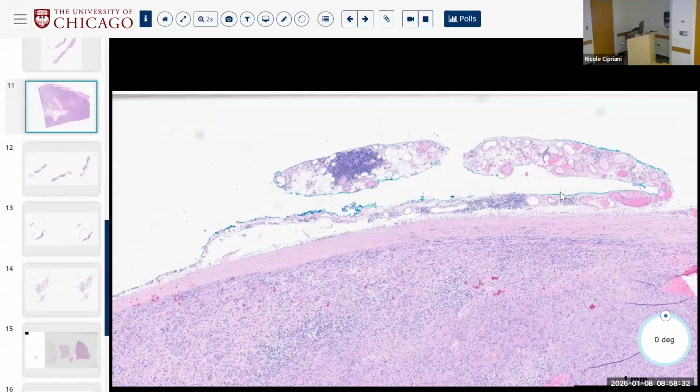Yeah. So classically, they tell you that leiomyosarcoma in the retroperitoneum is a primary differential. Are we now learning by molecular that most of these are actually MDM2 amplified? Many of them are MDM2 amplified. The primary leiomyosarcomas of the retroperitoneum are usually, or by definition, not MDM2 amplified, and are generally associated with a large muscular venous vessel.